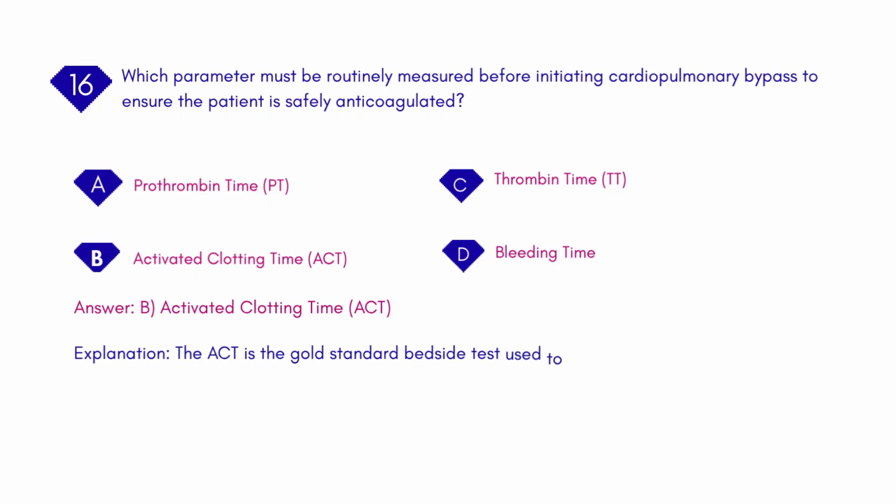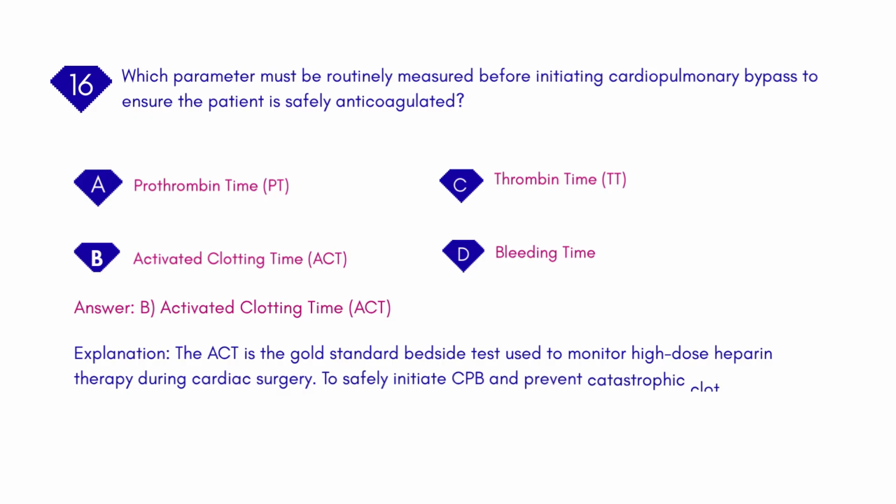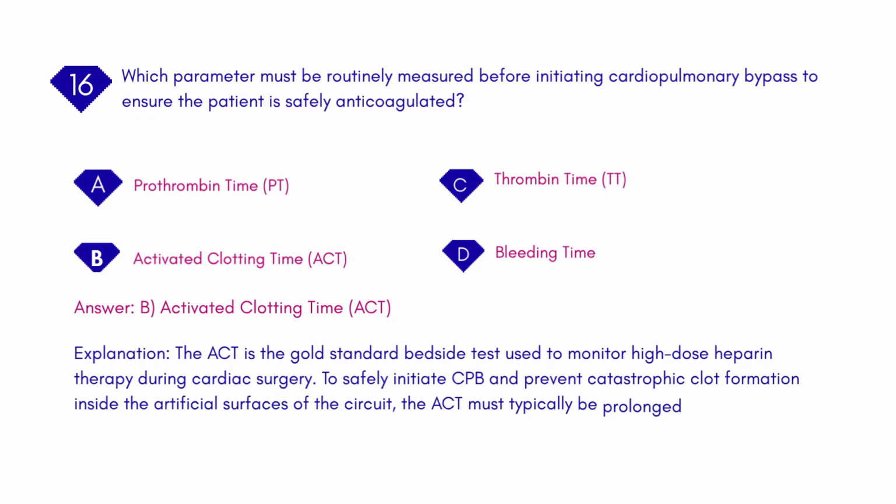Explanation: the ACT is the gold standard bedside test used to monitor high-dose heparin therapy during cardiac surgery. To safely initiate CPB and prevent catastrophic clot formation inside the artificial surfaces of the circuit, the ACT must typically be prolonged beyond 400 to 480 seconds.